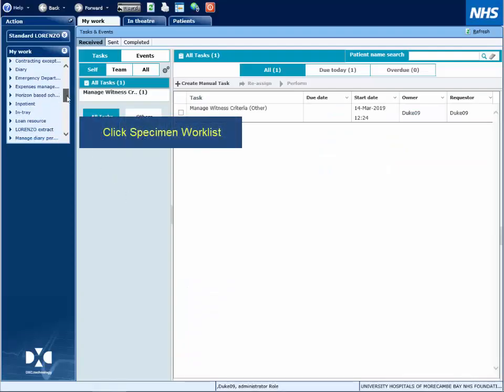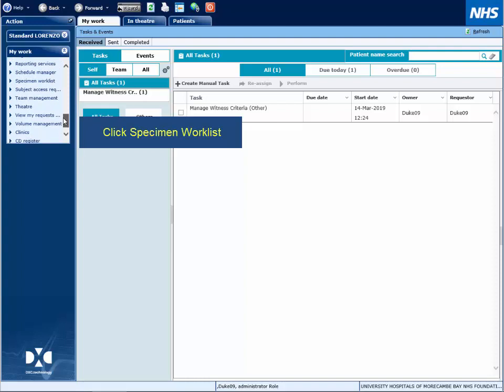Hello dear patients. From the top left, scroll down and select Specimen Worklist.